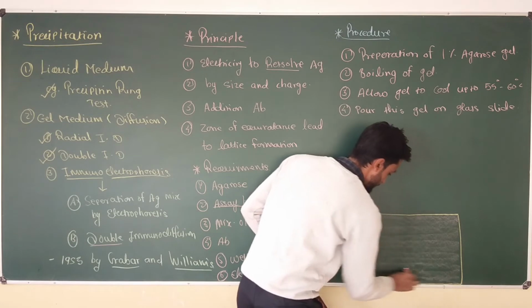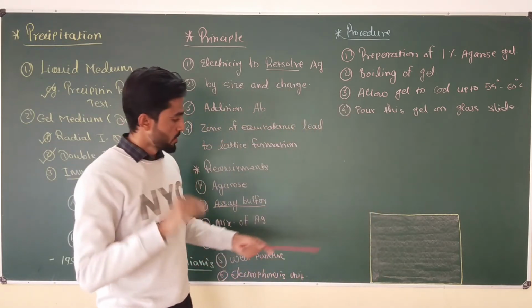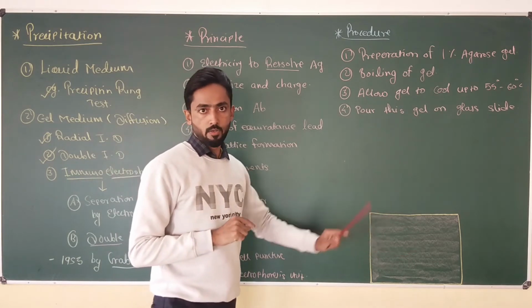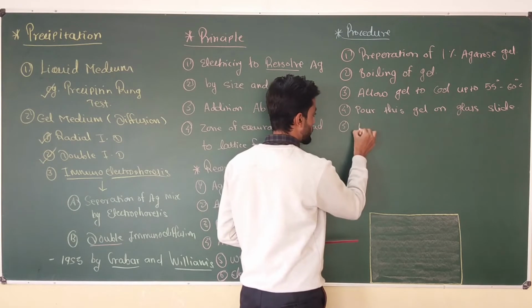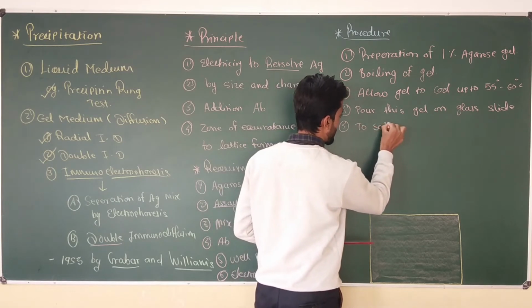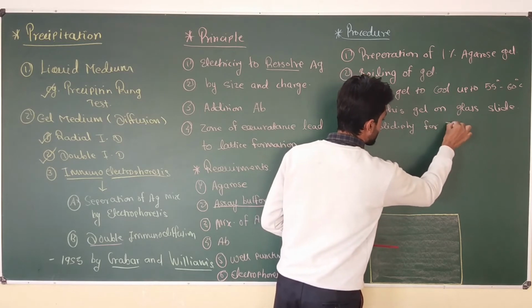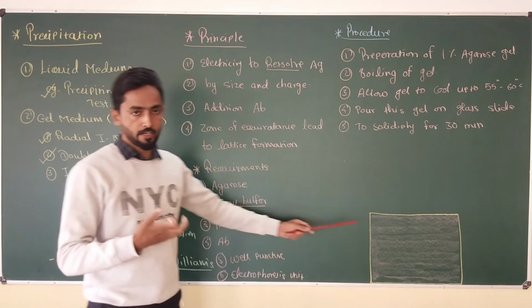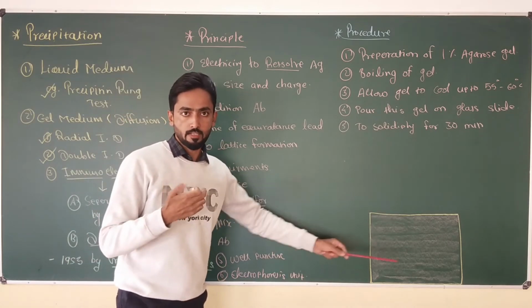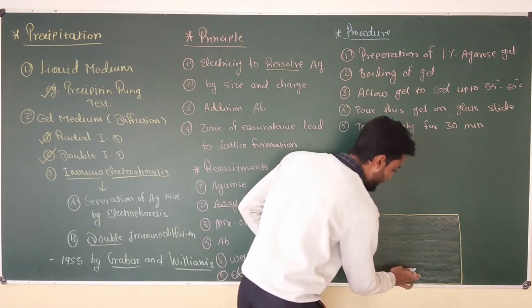It will make a thick layer of agarose on the slide. The next step is to allow it to solidify for 30 minutes.